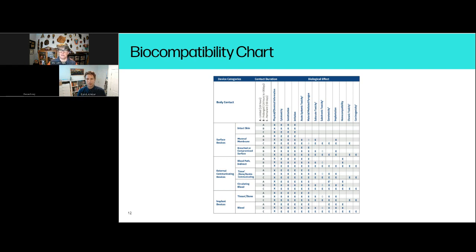I think right now it's still only electronic testing, but they're working on expanding it. So in the long run, you'll be able to look there. There's also A2LA accreditation, which is what Empirical has, and some labs have that available. It's not as commonly used as it is in mechanical test labs, but it's getting there.